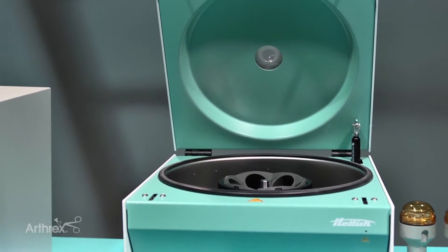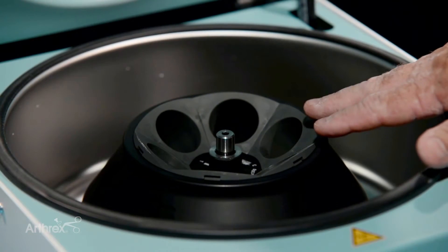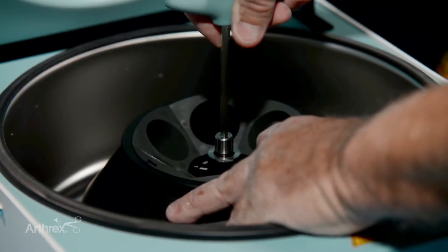The beauty of having the Hettich centrifuge is that we can provide IRAP when we need it with the IRAP rotor, and then we can swap out the IRAP rotor for the ACP rotor, which we're going to do now. So you can do two different types of blood treatments with one centrifuge.